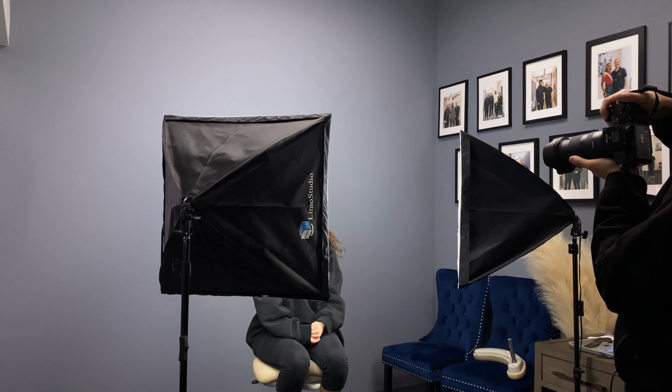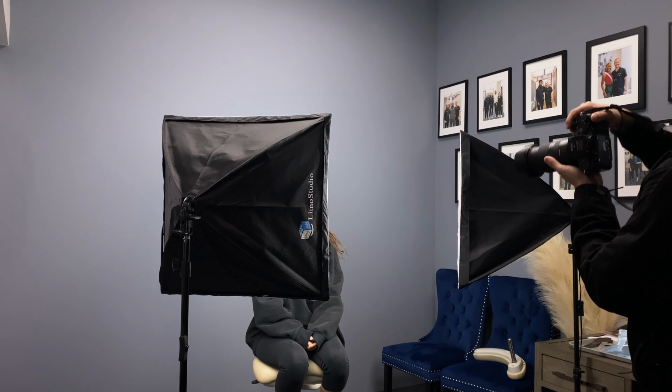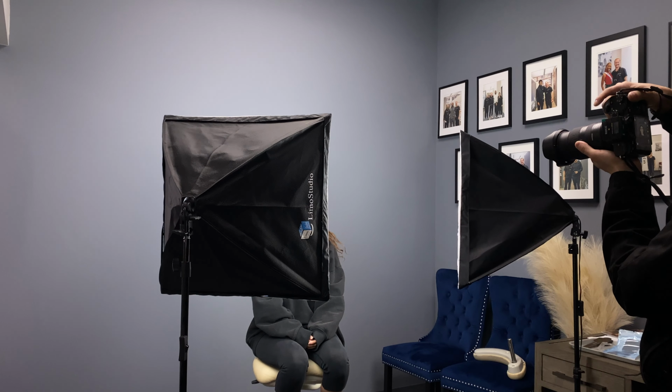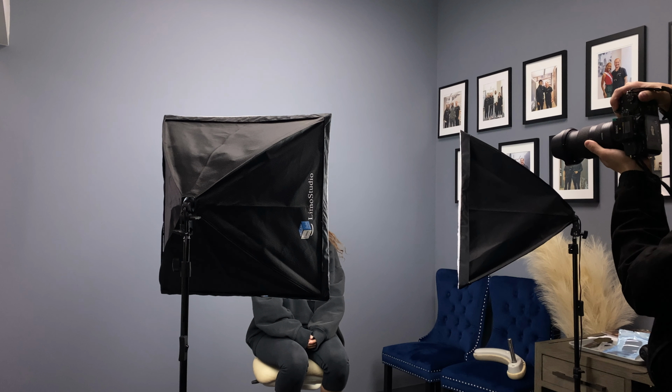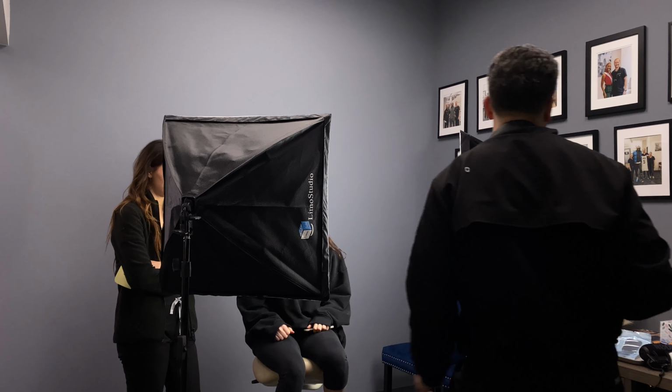And all these shots are done at 75 millimeter. Now you notice this room is probably about a 13 by 10 room, and I don't have a whole lot of space. So if I used a 100 millimeter length lens, it'd be very tight, and I wouldn't get the whole face and the whole shoulders in the frame.